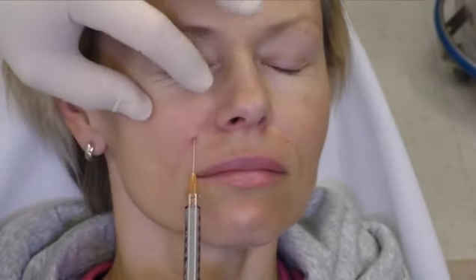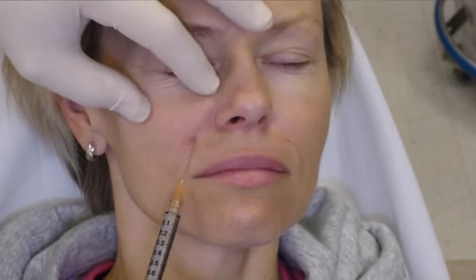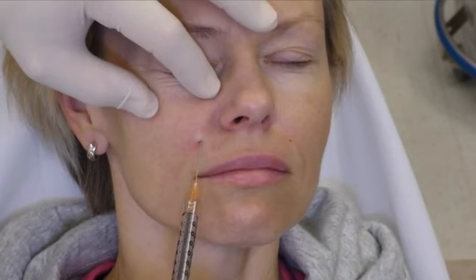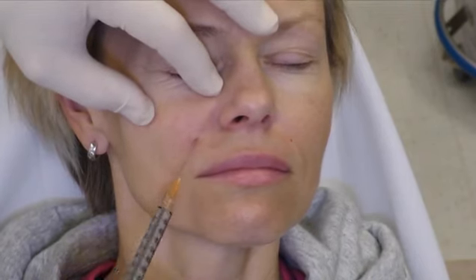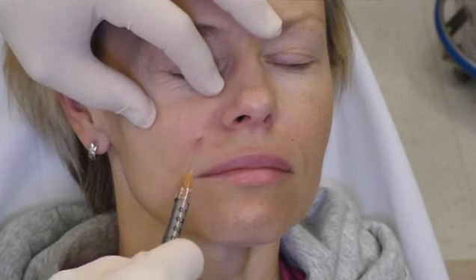Here you can see the cannula has passed largely to the lateral extent of the peripiriform space and is now redirected towards the medial aspect of the space. Injections are done on withdrawal, and care should be taken not to inject the product as a bolus.